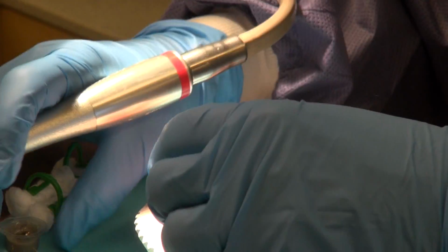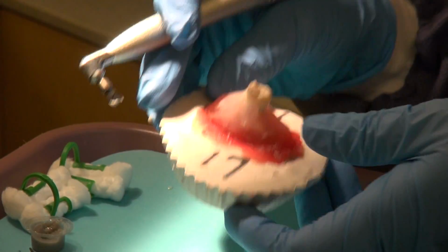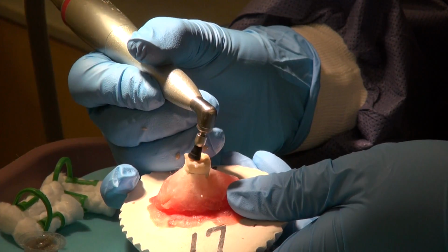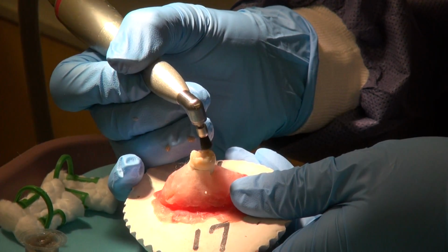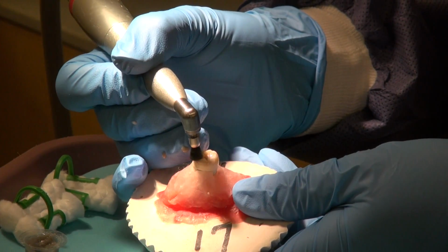We are just cleaning the occlusal surface to place a sealant. We are not polishing teeth at this point as dental assistants. That's a hygiene function. We just want to get into those grooves so when we acid etch this tooth and place the sealant, we have a nice mechanical chemical lock.